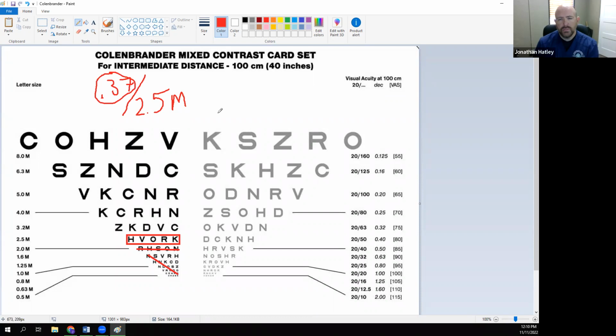Note right up here that this is kind of an odd number, and that's okay, because what the clinician should do whenever they ask the patient to hold the card at their habitual reading distance is get out the tape measure and measure this distance. In this hypothetical example, the distance the patient was holding the card at was 37 centimeters away from the spectacle plane. And so in this case, we would say 0.37. We list the distance in meters, just like we did with the Snellen or the ETDRS acuities earlier. So now let me remove this real quick.